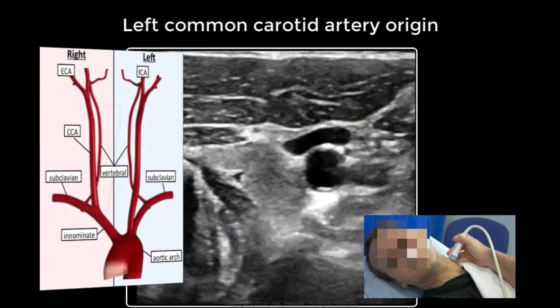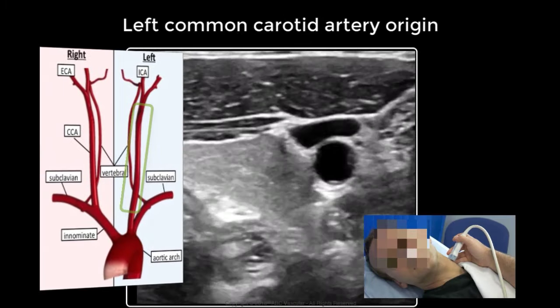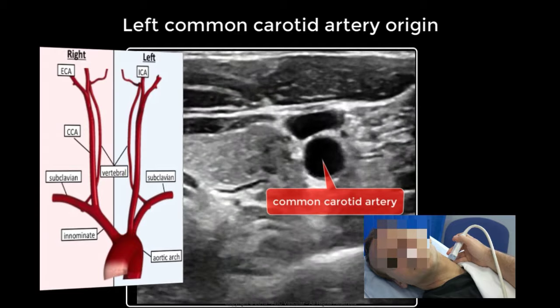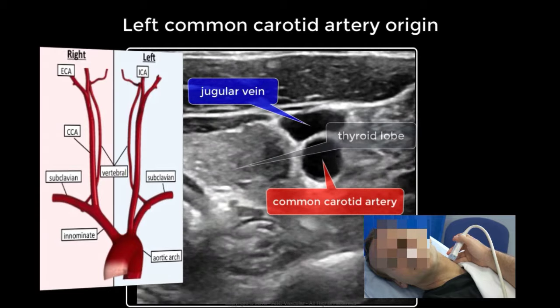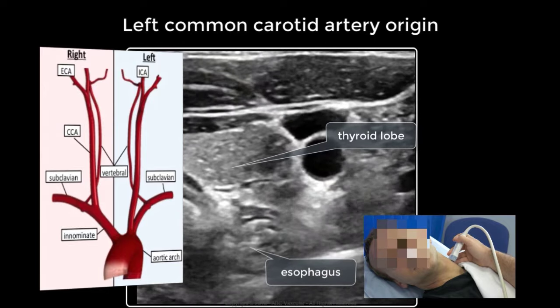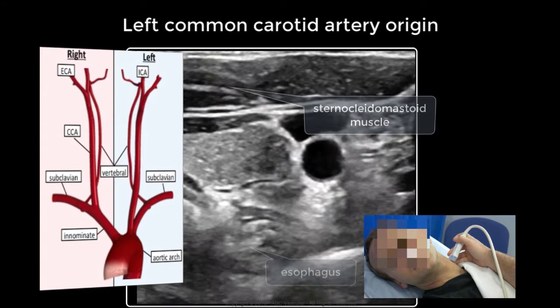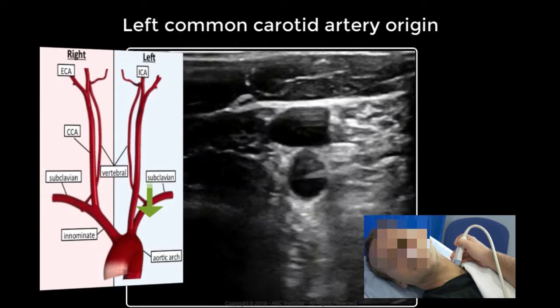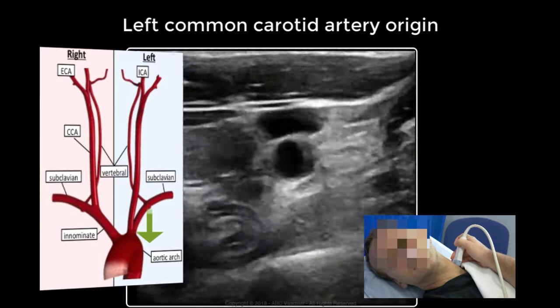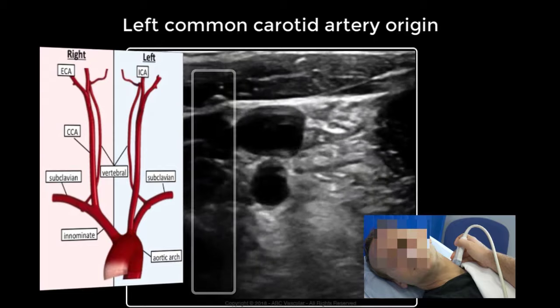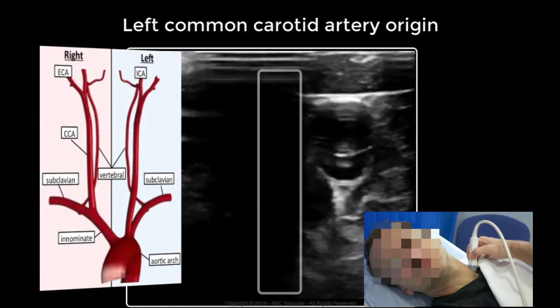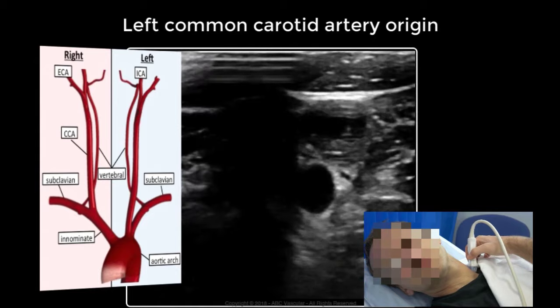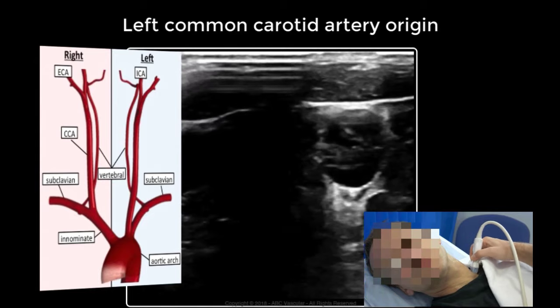The origin of the left common carotid artery may not be visualised. First, identify the origin of the common carotid artery in transverse view — the jugular vein, the thyroid lobe, the oesophagus and the sternocleidomastoid muscle can be visualised. Move the transducer down towards the base of the neck, tilting the transducer downwards. An acoustic shadow will appear on the screen. This shadow is caused by the clavicle and represents the main obstacle to visualising the origin of the left common carotid artery.